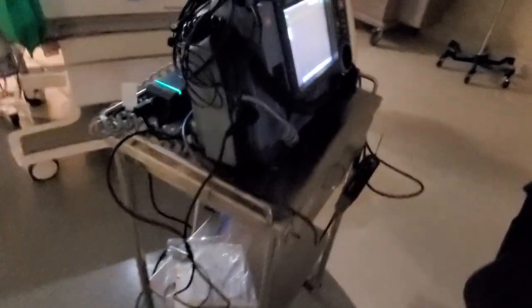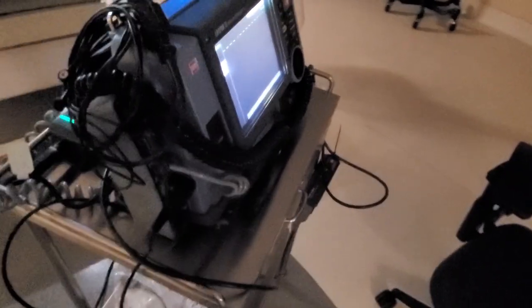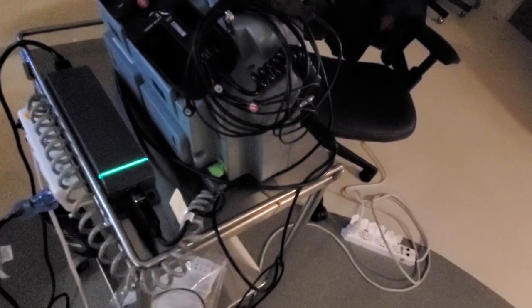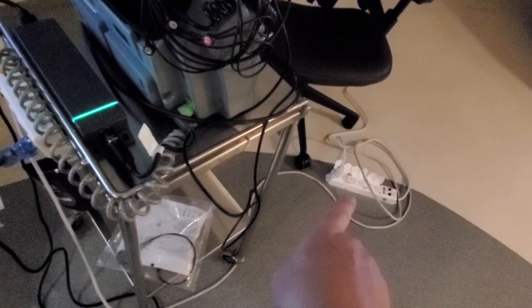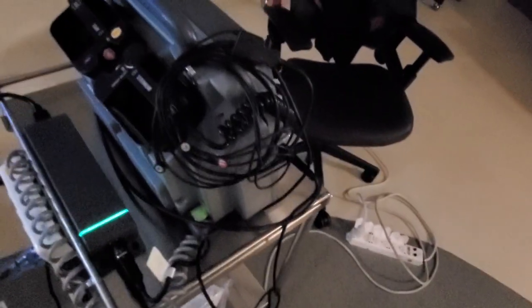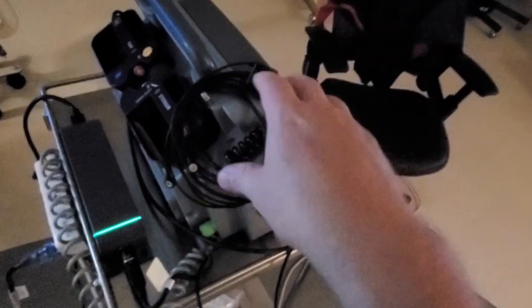I'm gonna come on over here. So this is also a big thing. We have defibs. Now this is the only defib of this type that I have in any of my accounts. But one of the things that you want a defib to be is rapidly deployable. Yeah, that's a whole nother subject right there. But look at how the leads are just kind of thrown up here. This isn't as bad as some of them I've seen, but they should be neatly wound and stowed. Like, I push them right up here so that these leads, you can just grab them and use them.